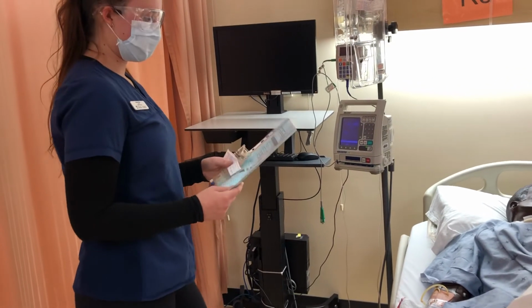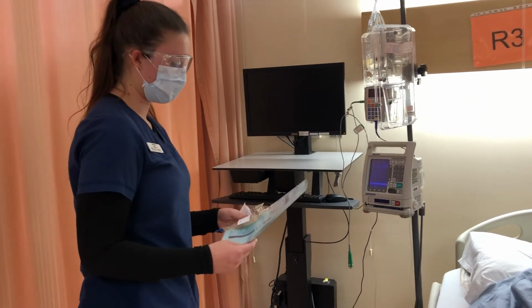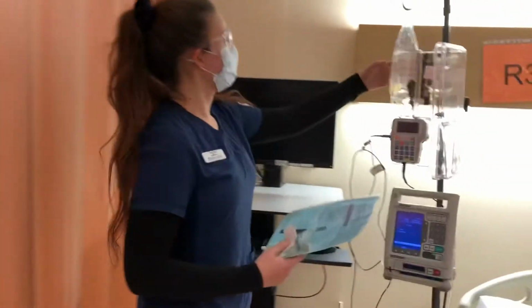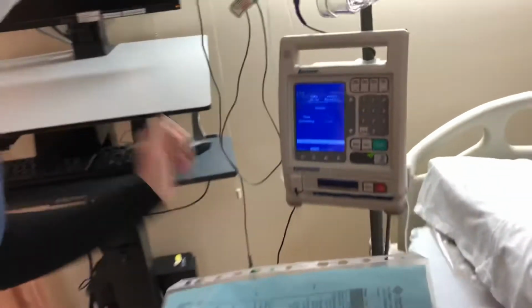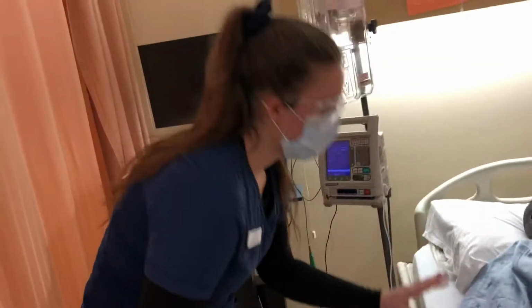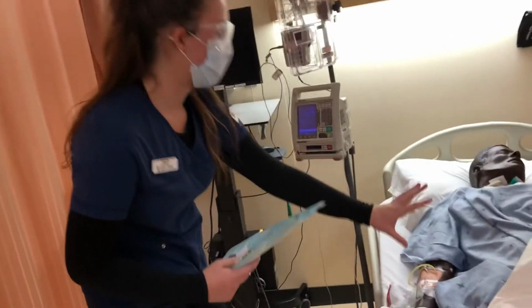I've assessed your baseline vitals, respiratory, and mental status, and I will be assessing that very frequently after I start the infusion. Do you have any questions before I begin? And do you consent? Great, so I'm going to take a look at what's currently infusing. I'm seeing that normal saline is here, which is compatible with my medication, and it is in the pump running at a TKVO rate. So I'm going to follow the tubing all the way to my patient to make sure all the clamps are open. And they are, which means that it's infusing, and I'm not noting any swelling, redness, or irritation at the IV insertion site, so I know that that is a patent IV.